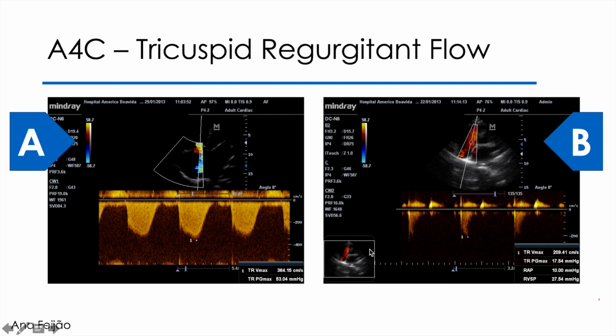with high velocities, I use CW Doppler. I place the cursor in line with the regurgitant flow and press the CW command again to call up the velocity graph. Do not forget to orient the baseline and the velocity scale so that we can visualize the peak of the curve to be studied. And we must also orient the gains and filters so that the entire spectral curve is well defined.